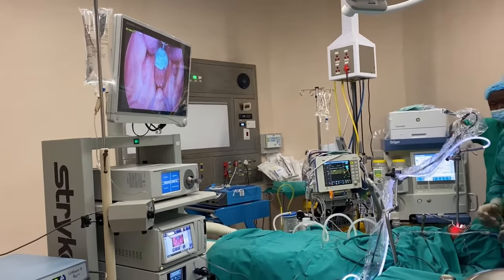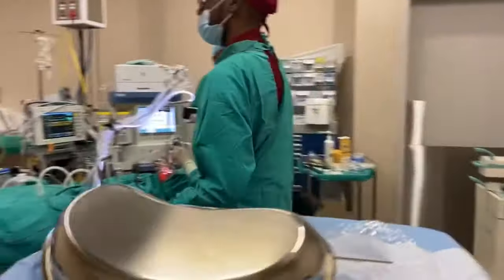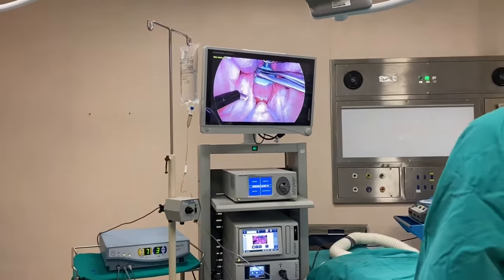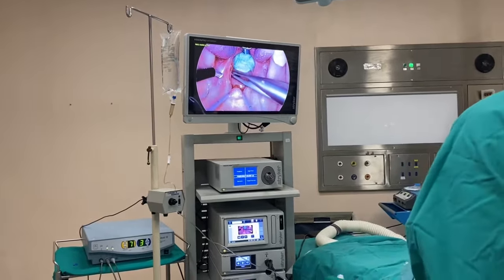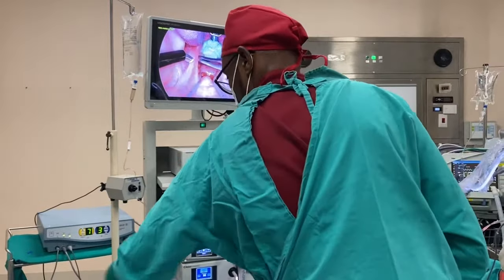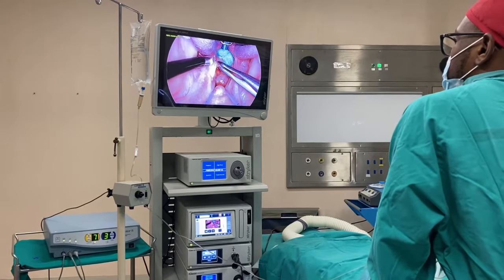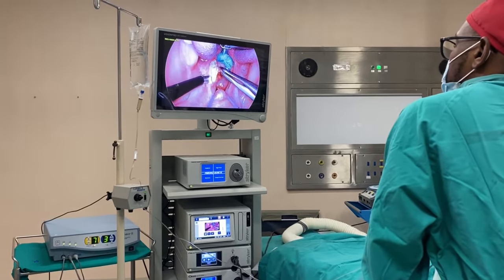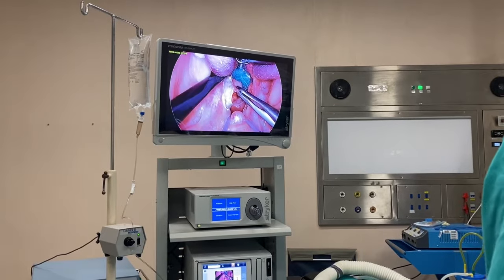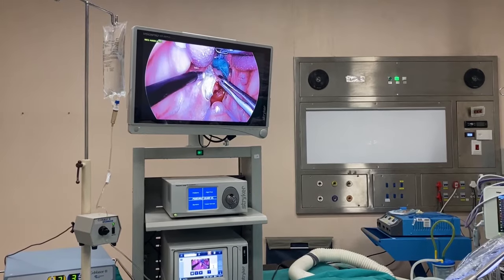This is beautiful and very nice. Okay, I can see this. So that's the tonsil. That is the anterior pillar. You see that, Sadiqi? And then behind there is the posterior pillar. Inside there is the tonsil. And that place is called the tonsillar fossa. And that is the coblation device you are using. As I touch, the water touches the tissues and they undergo a redox reduction reaction — remember from chemistry? And then we separate the tissues.